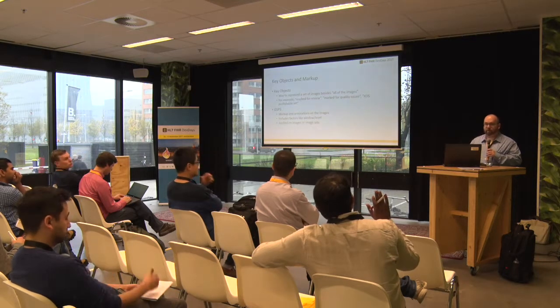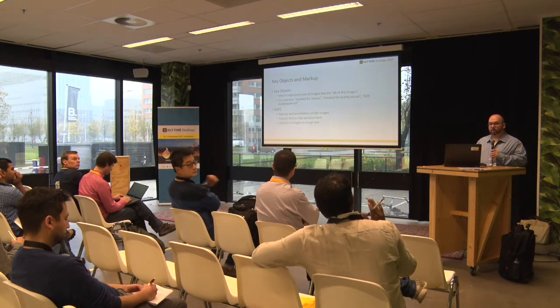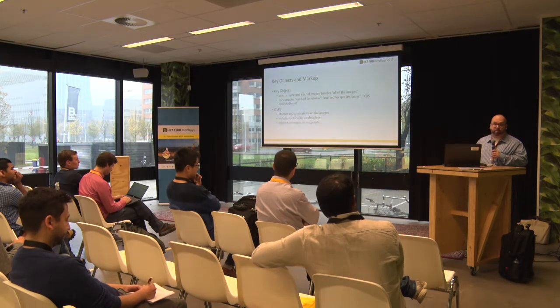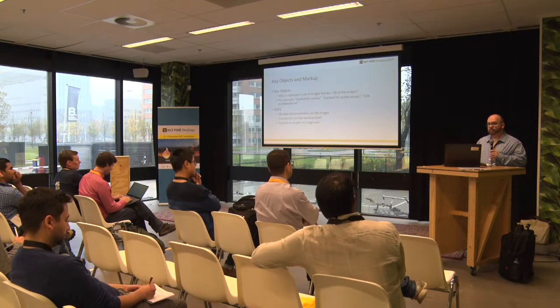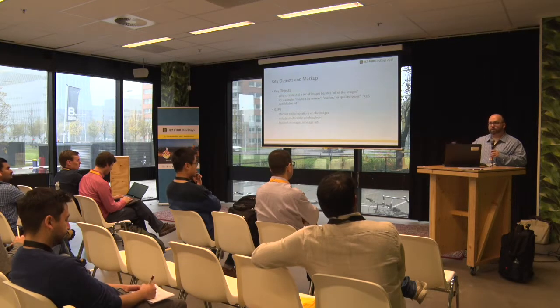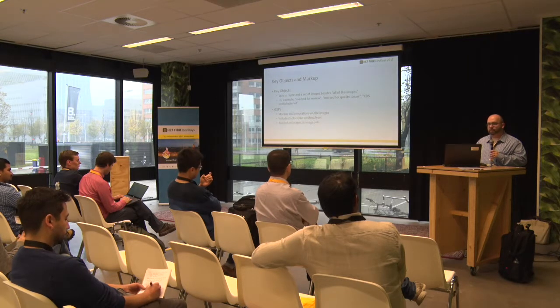So if you change the metadata, you don't need to change the identifier, isn't it? For example, if the patient gets married and their name changes, in that case you don't have to change the identifier. But if you're going to change, for example, left or right, because you messed up the laterality, you change the instance. You retire the old instance and you use the new instance because you're significantly changing the payload of the data itself. Okay?